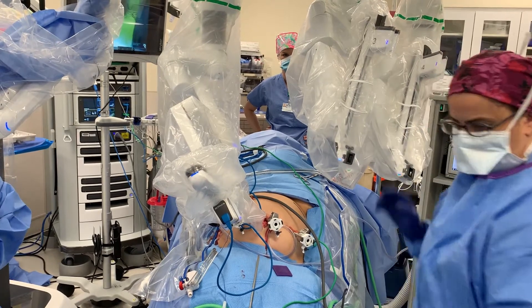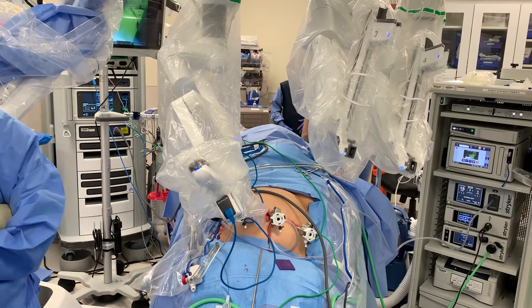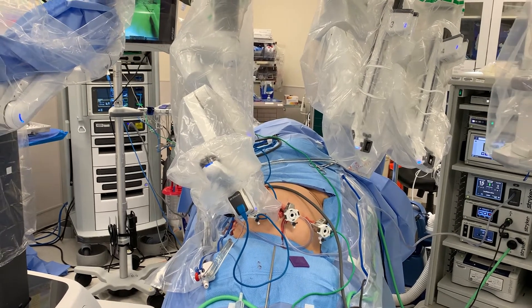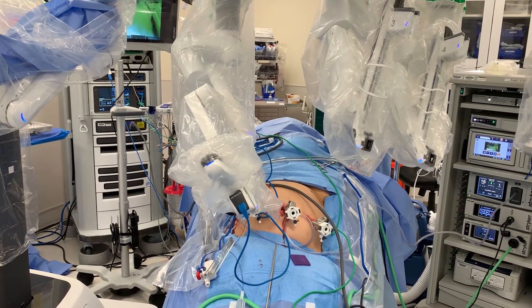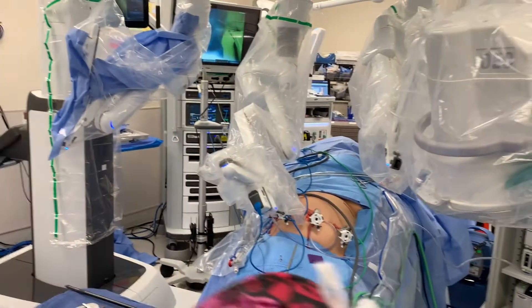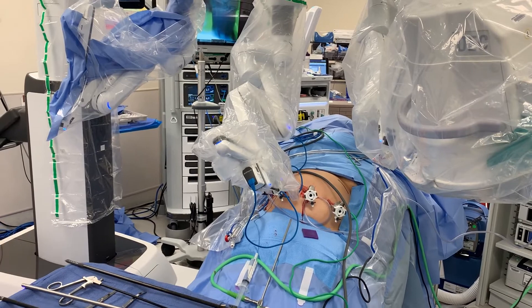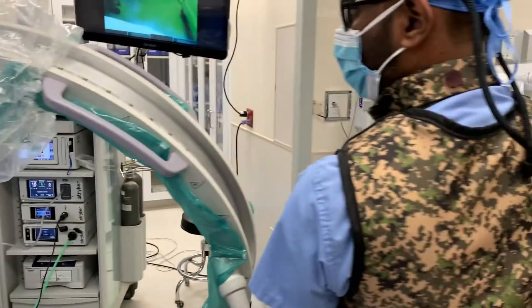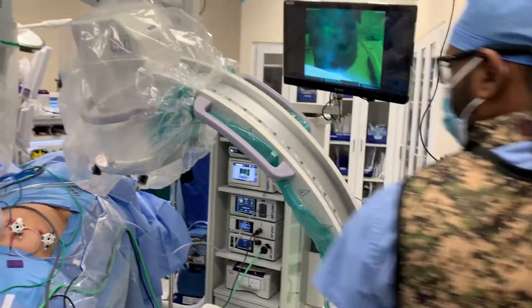The patient is in reverse Trendelenburg, so the fluoroscopy machine will come from the patient's left. The fluoroscopy machine, as can be seen here, is actually angled to match the incline of the bed so it can easily slide under the patient.